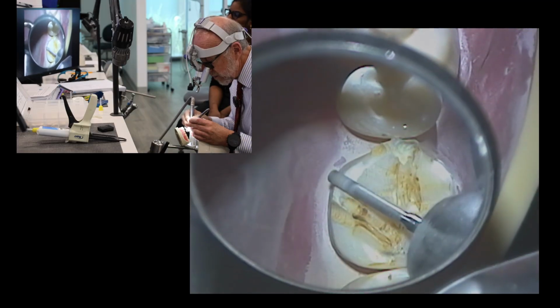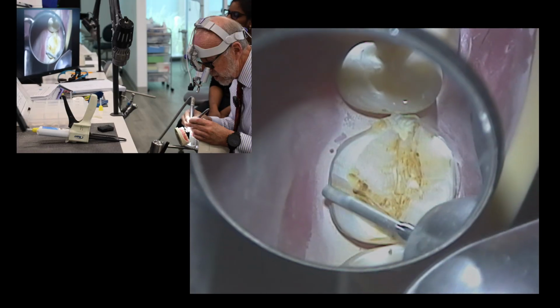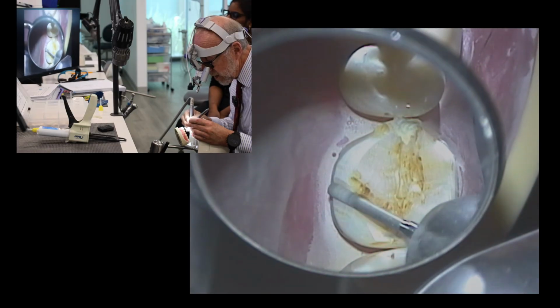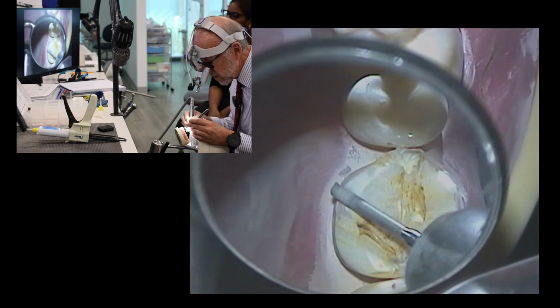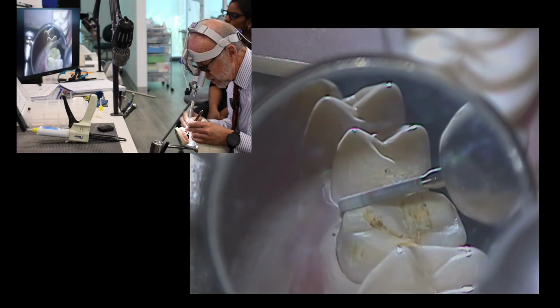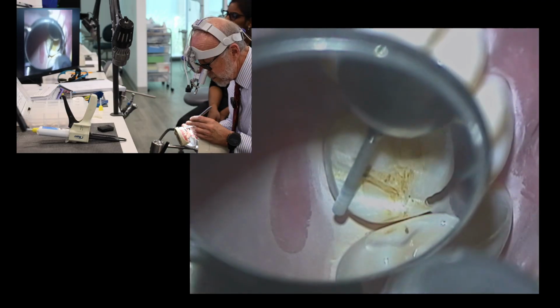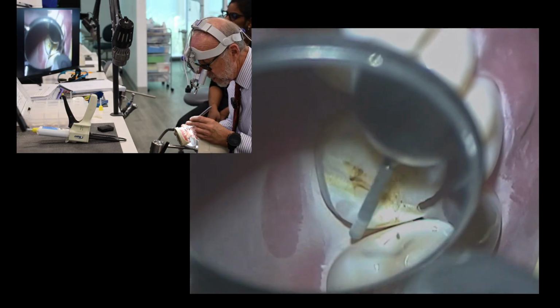That's what you didn't do. So keep it pointing diagonally from here into the groove and then all the way from here into the groove. Then that'll give you a vertical angle that's going to match the opposing tooth pretty much automatically. Then just finishing around the corner this way.